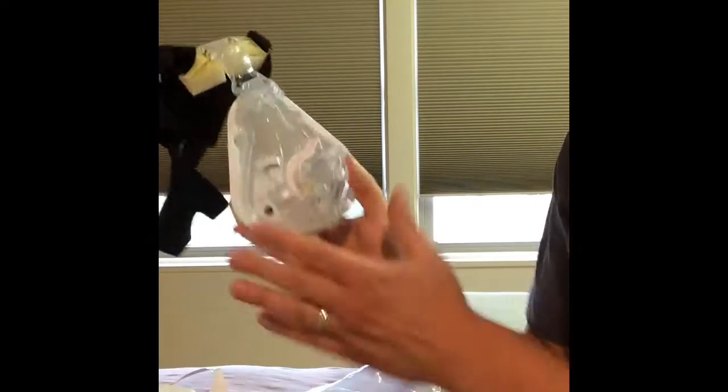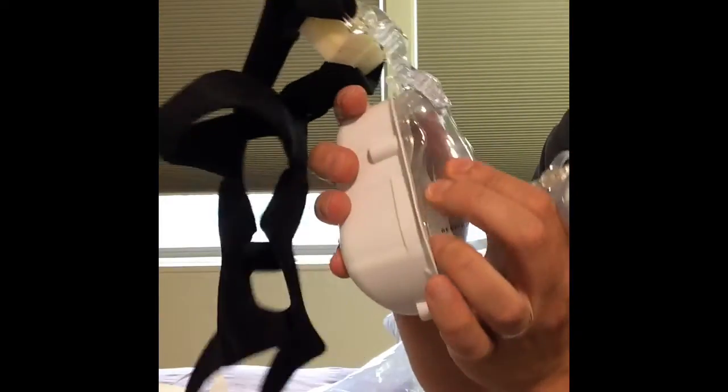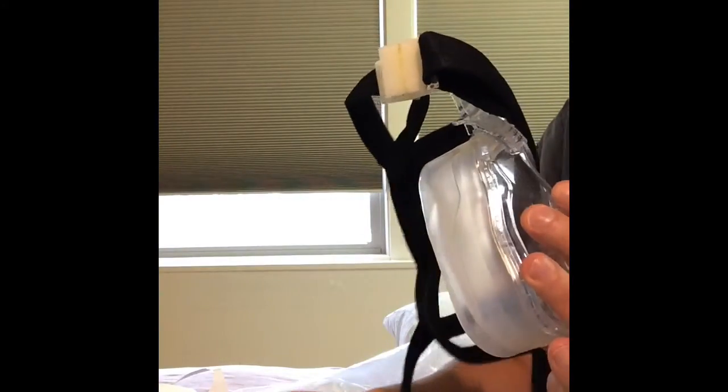You're going to be taking your mask out of the bag. Make sure that you take the back piece off. Also on the foam here, there's going to be a little plastic piece. Make sure you're taking that off as well.